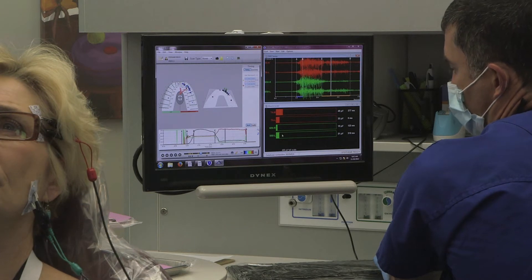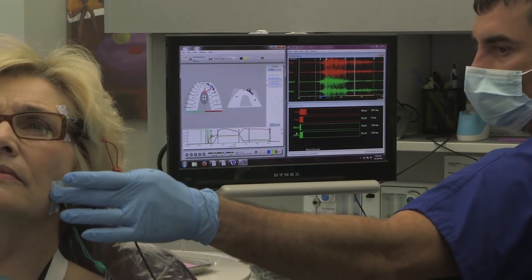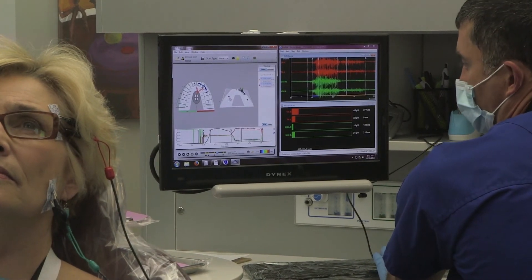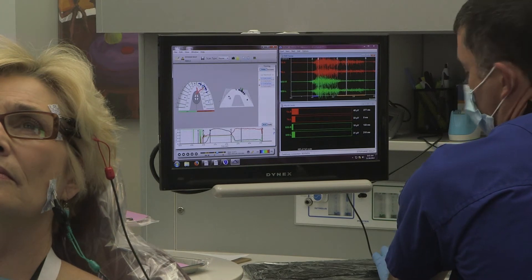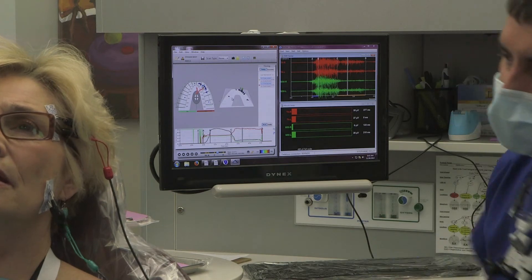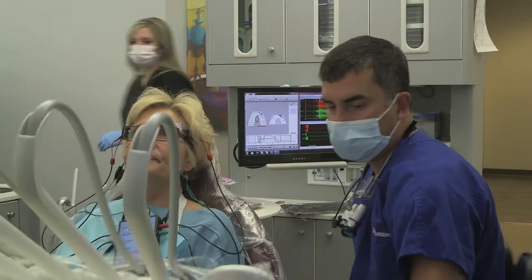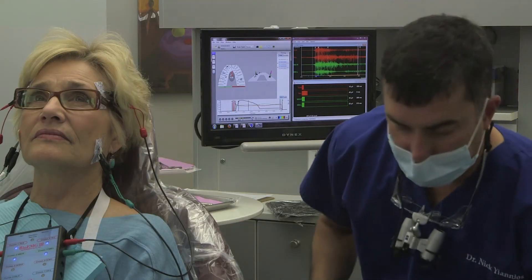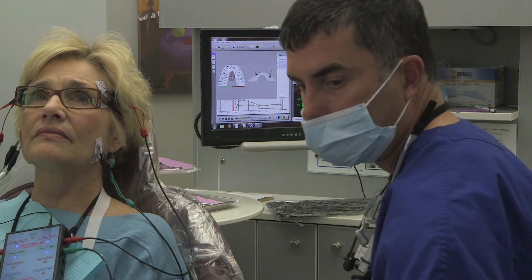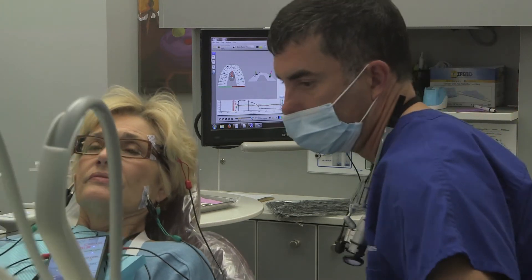And why is this one not? This left masseter — your left clenching muscle right here — why is that one hyperactive? Well, at that moment in time, that little glitch right there is what's causing it. Interesting. Now you understand what I'm saying with muscle and bite? How I can see how it works together. And these are things that normal dentistry can't find. I can't even find it unless I'm using this gadgetry. I'm always aware of it and trying not to introduce errors. But this is why this is so cool.